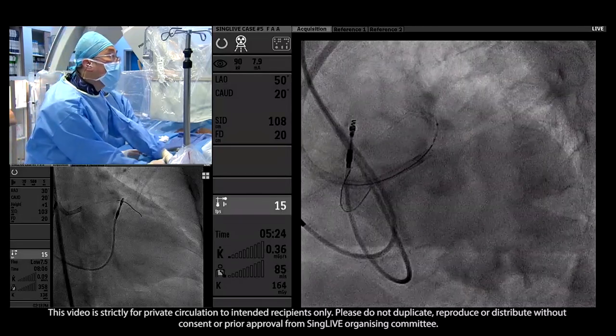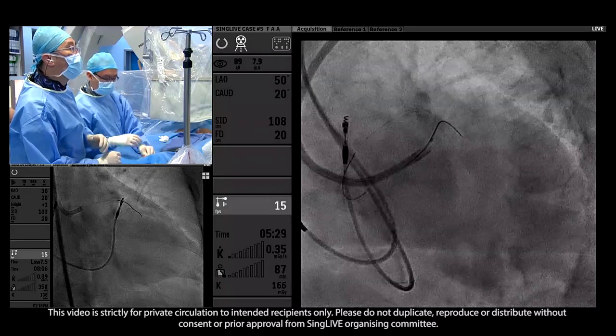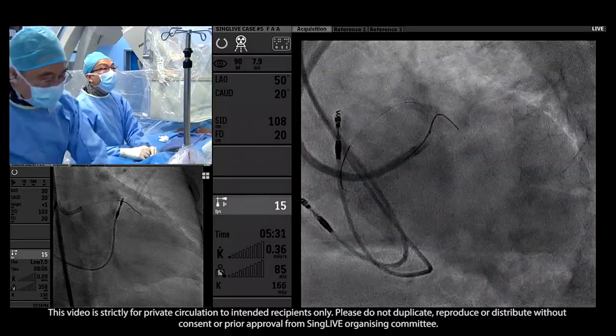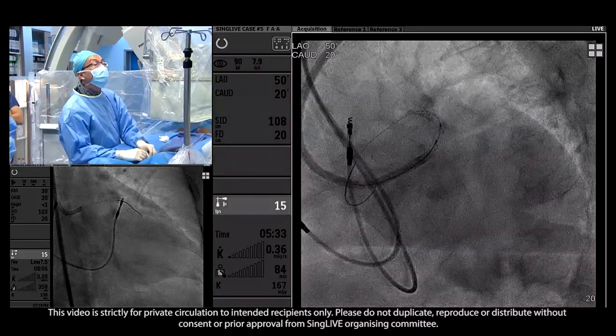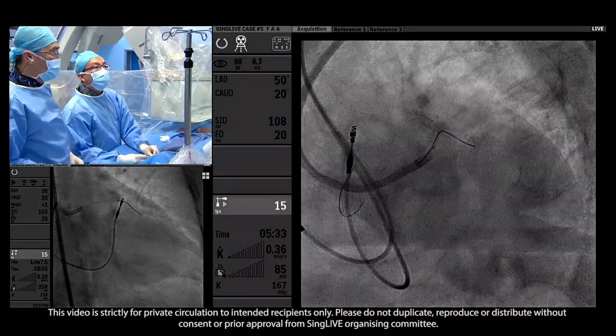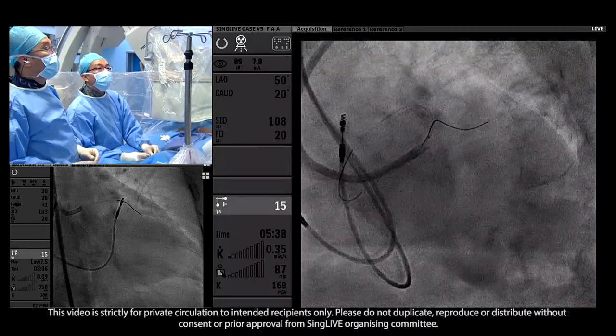Can I say something, Aaron? Yes. Say about the tapered stent, I have one reservation: if you're going to post-dilate every stent, then this tapered property has no meaning, because it is no more tapered. The final balloon dilatation gives the shape. That's the shape. So I don't think so.